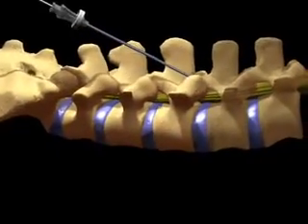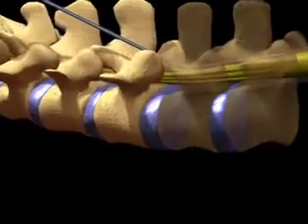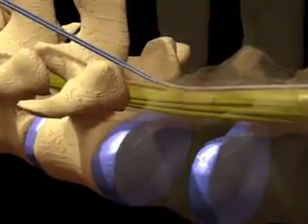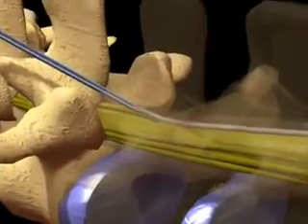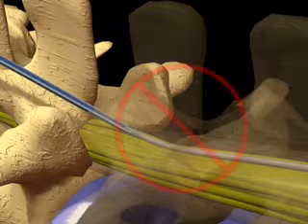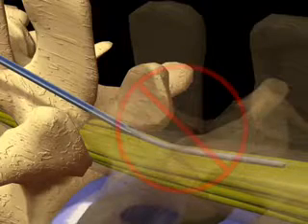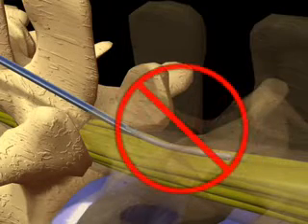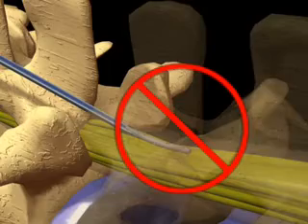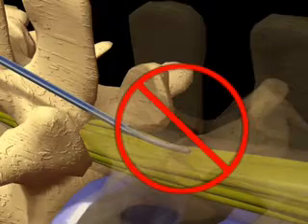Do not withdraw the catheter through the introducer needle. This can partially cut the catheter or completely shear off the catheter end. A partial cut can cause drug leakage, while a complete shear can leave a disconnected catheter segment in the intrathecal space.